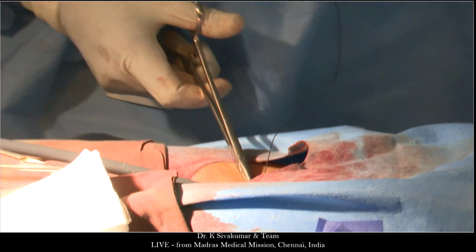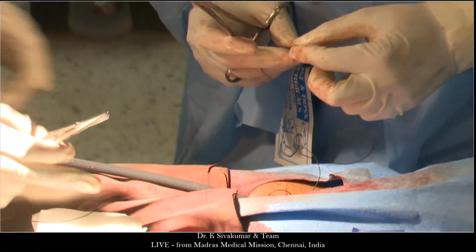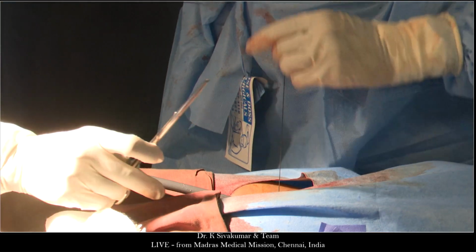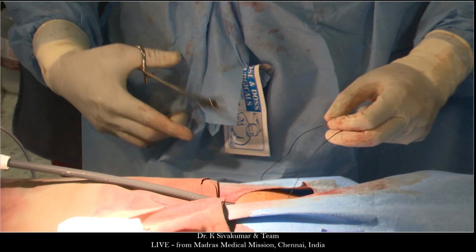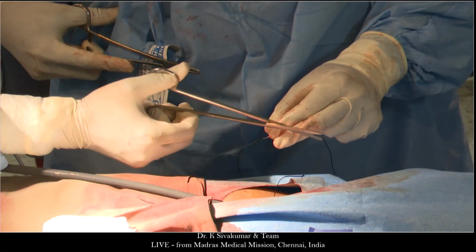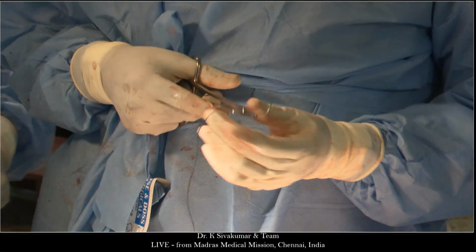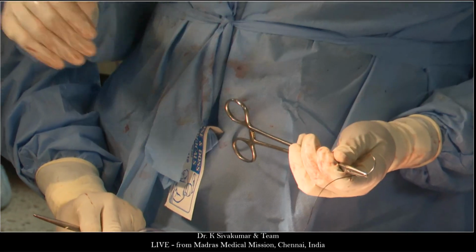I heard the question partially. Is it about the pulmonary vein getting occluded? The question is on the higher pulmonary vein. Have you had cases where there is some stenosis and decrease of flow that you had to go back and dilate the strut into? No, not at all. So far, no. Actually, in all the cases, what we do is we mount an uncovered stent on the top and then a covered stent on the bottom.